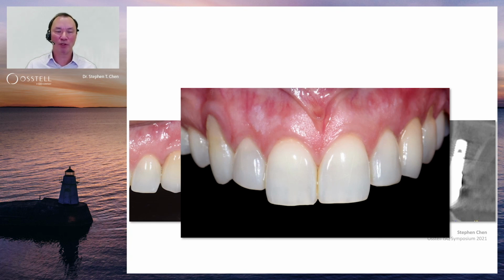Of course, the big blemish is the right canine, which is the other tooth that was transplanted from the palate. And at some point in time, when that one undergoes resorption, we'll replace the tooth at that stage. But at this time, patient's happy to retain it the way it is. So this is an example of an early implant placement approach to take advantage of the soft tissue healing and the ability then to reconstruct the missing facial bone with the GBR procedure for contour augmentation. A really good example and showing a very satisfactory outcome.